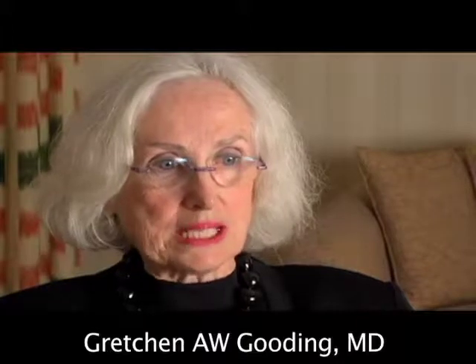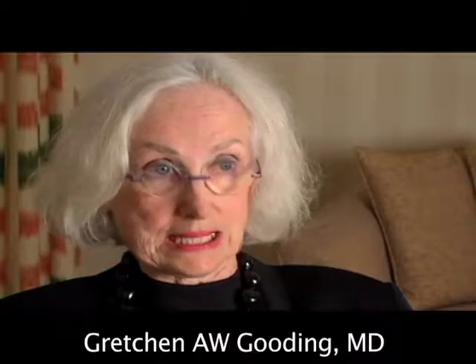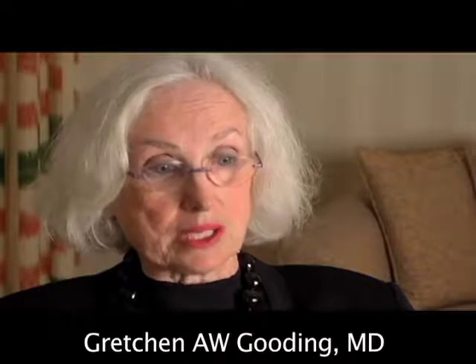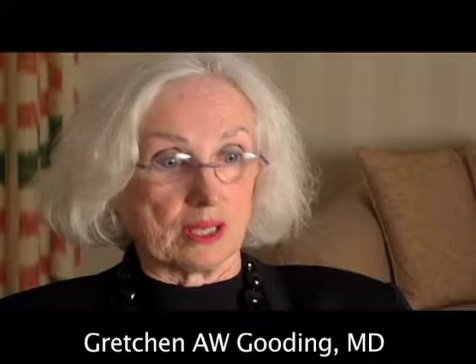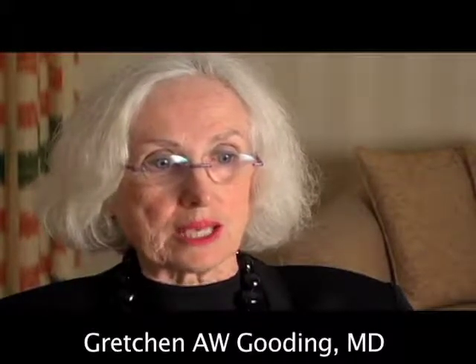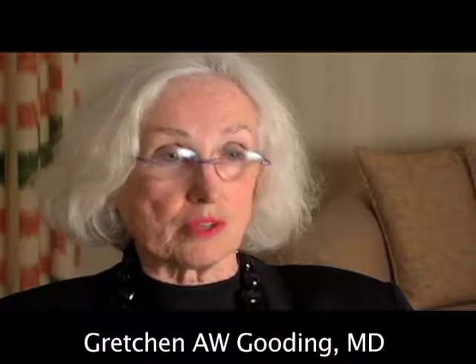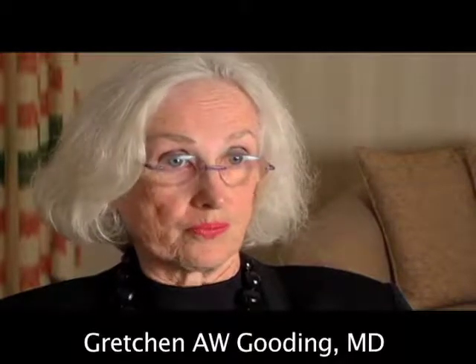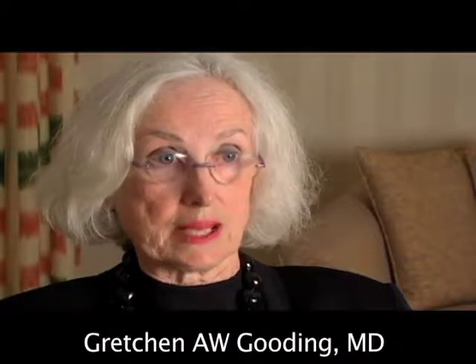And I'm going to speak today about extracranial carotid ultrasound and the diagnostic nuances involved in that. Carotid disease is common, particularly in elderly men, especially those who have a history of smoking. And diagnostic ultrasound plays a really important role in deciding which patients can benefit from surgery or stenting and which patients are relatively normal. So it's an excellent screening test, and that's what I'm going to discuss today.